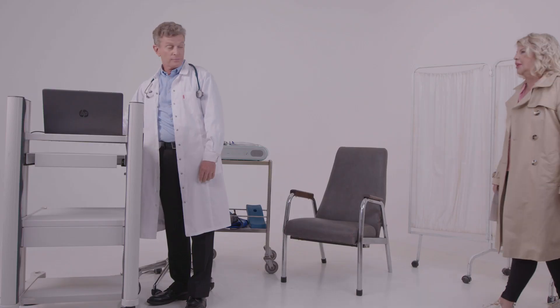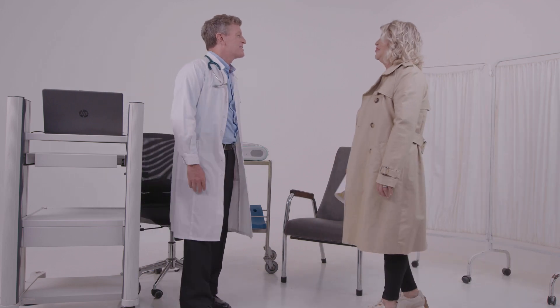When a patient arrives, use his previous blood pressure values or measure one at least 30 minutes before the test. Perform the measurement on the non-occluded arm. Explain to the patient how the test is conducted.